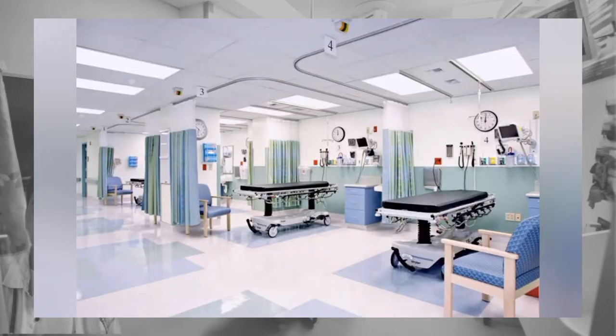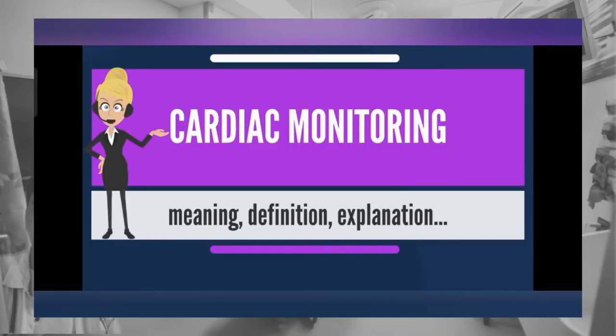Most commonly used in emergency rooms and critical care areas, bedside monitors can be interconnected to allow continual observation for several patients. Continuous cardiovascular and pulmonary monitoring allows a prompt identification and initiation of treatment. In general, the cardiac monitor provides a visual display of many patient parameters.